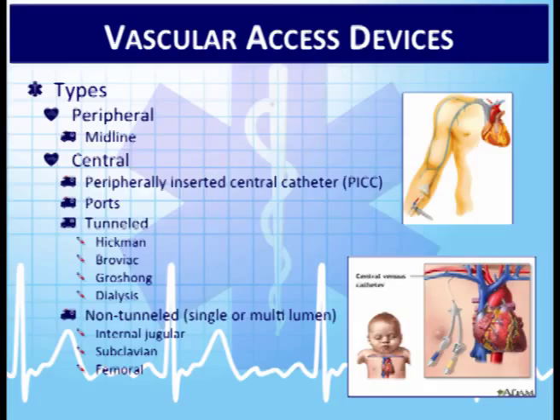The central catheters are the PICC lines, so it's the peripherally inserted central catheter. Many times you'll just see that PICC abbreviation. Ports, we'll talk about the med ports. There's tunneled and non-tunneled devices, and we'll talk about the difference between those two. These are just different names that you might hear patients describe their device.